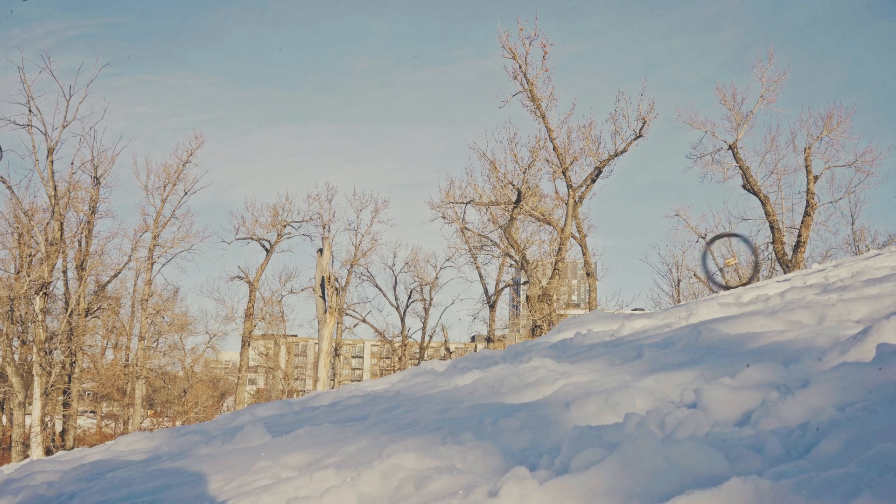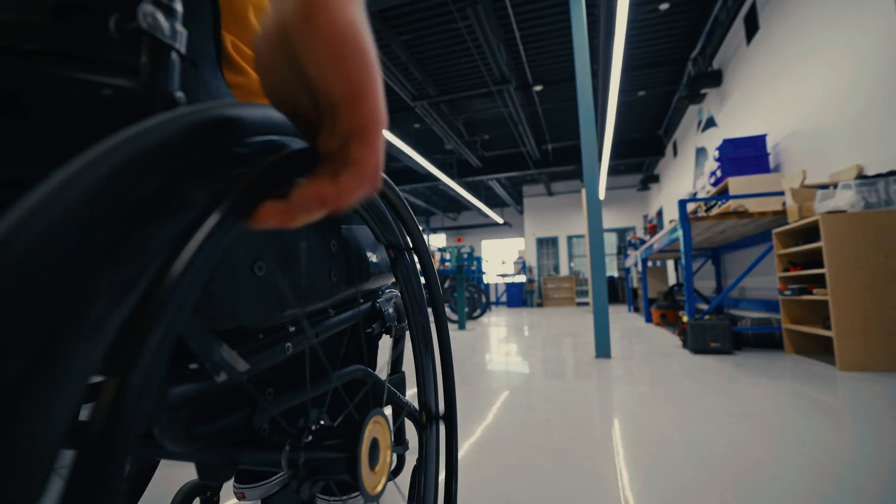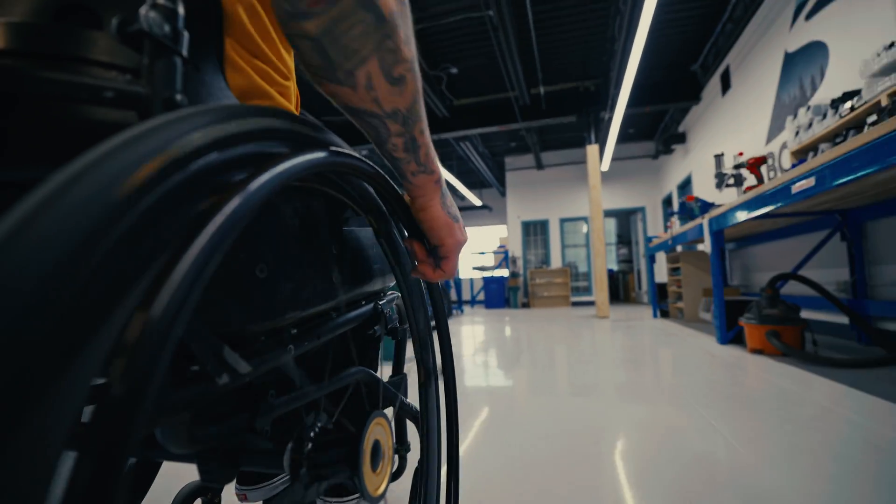The rim underwent both lateral and vertical stiffness testing, then it was sent for roundness and flatness testing. Once those were a guaranteed pass, we laced up our hub and it was sent for impact testing, where it withstood an impact energy of 75 joules.